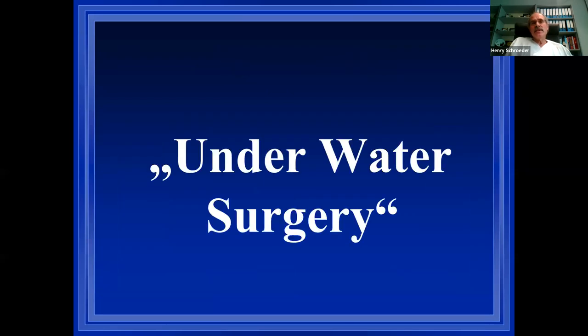The problem with intraventricular endoscopy is that it is underwater surgery. That means if you have a little blurring of the CSF, for example by bleeding, your view is immediately obscured and it's very difficult to handle. If you make movements and you don't see well, there is a risk that you injure the structures in the ventricle. So you have to be very careful.